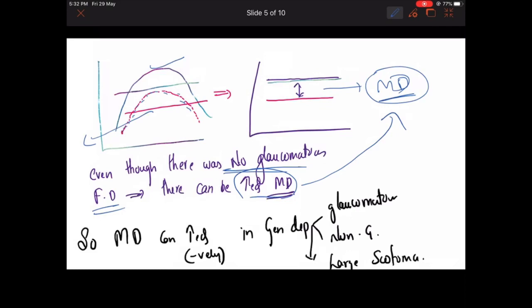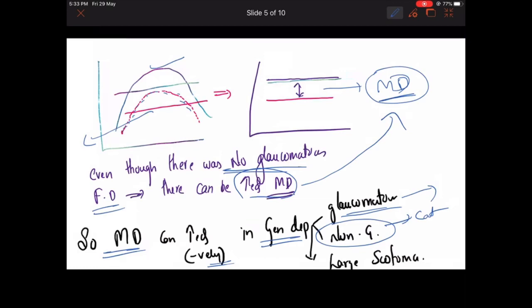In general, mean deviation can be negatively increased in case of generalized depression — seen in early glaucoma as well as in non-glaucoma conditions like cataract or refractive error. Also, in the case of a large scotoma, you will get a mean defect, but mean deviation alone will not differentiate whether the cause is a large scotoma or generalized depression.